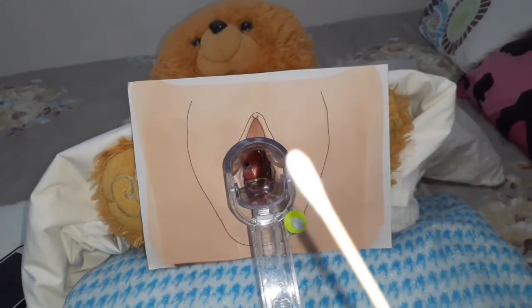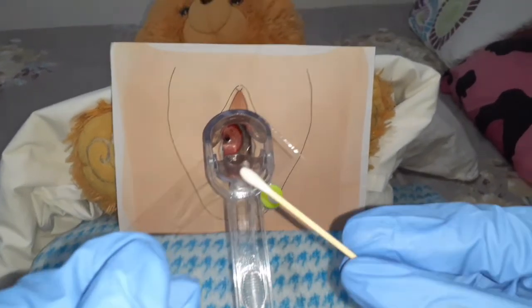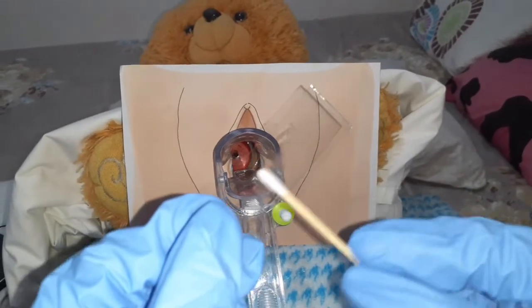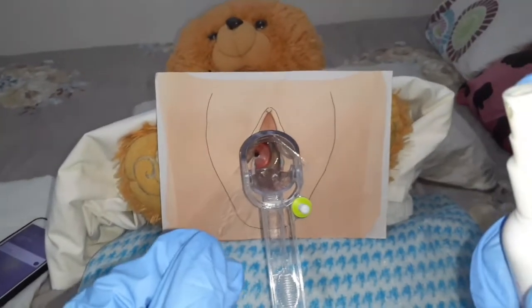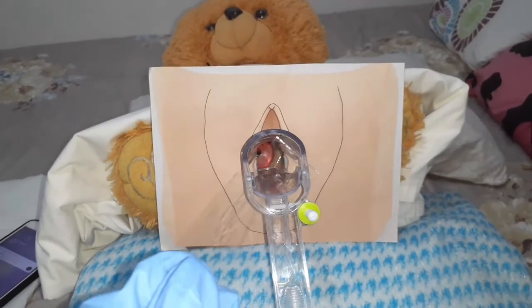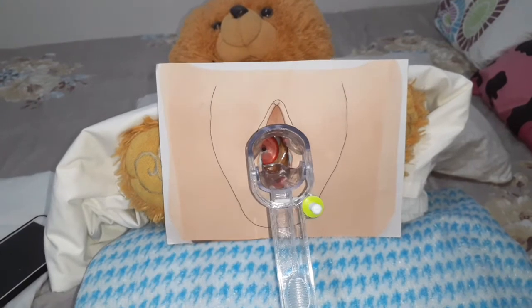Smear it onto the glass slide, making it as thin as possible. Then spray with fixative. Let's assume this is my fixative. Spray it about 8 to 10 inches away from the glass slide. Then set this aside.